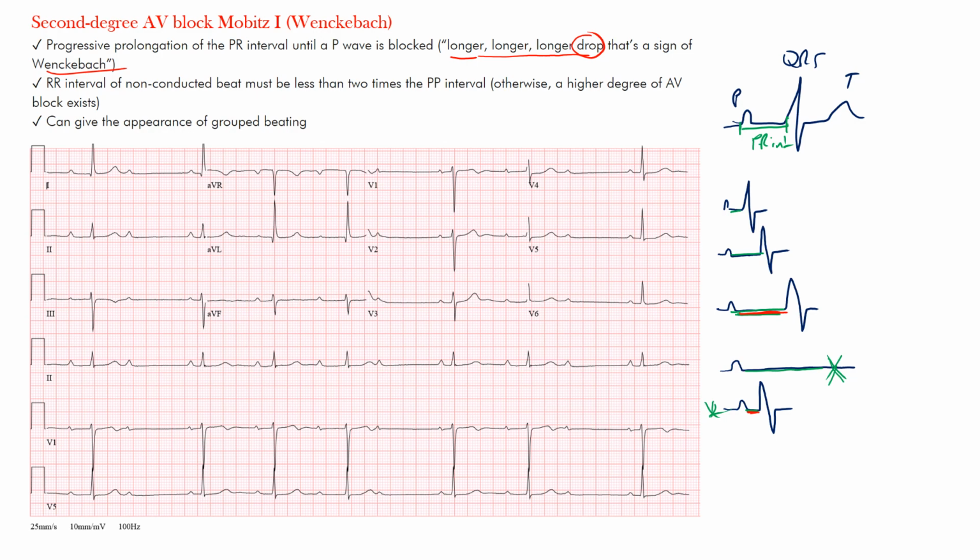Okay, so this is a reversible conduction block that occurs at the AV nodal crest or the atria-AV nodal junction. So what you can imagine, and if we draw our heart out here, this is our box diagram, our right atrium, right ventricle, and left ventricle.